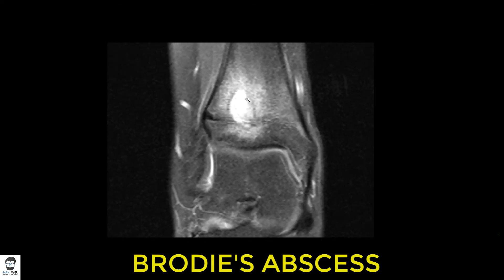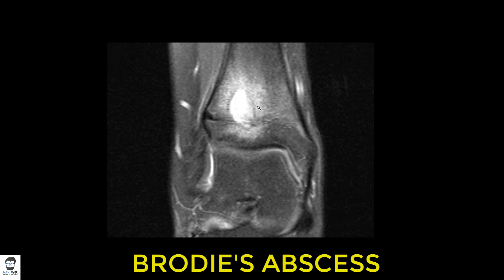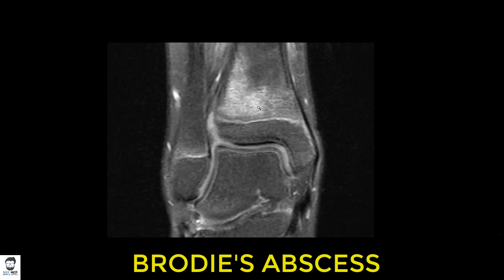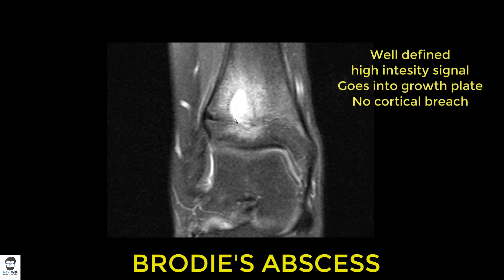Zooming into the lesion on the MRI, you can see this well-defined lesion on T2 coronal imaging — a whitish mass in the distal part of the tibia extending to the growth plate and slightly into the epiphysis. The lesion is approximately 90 to 95 percent within the metaphyseal area, with a small portion extending into the physis and epiphysis.